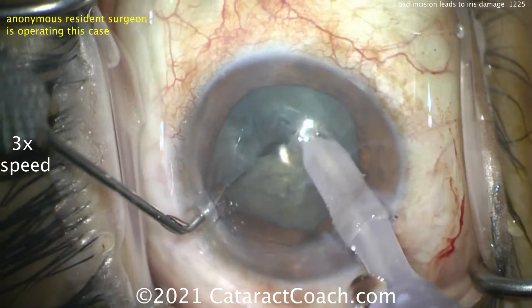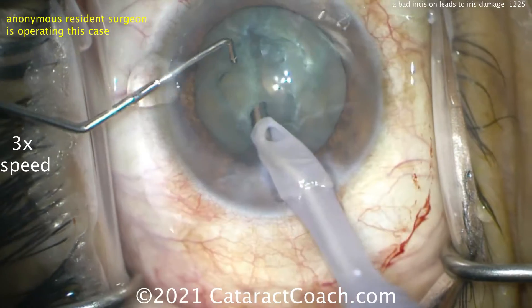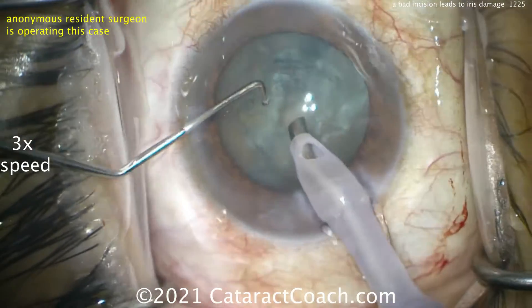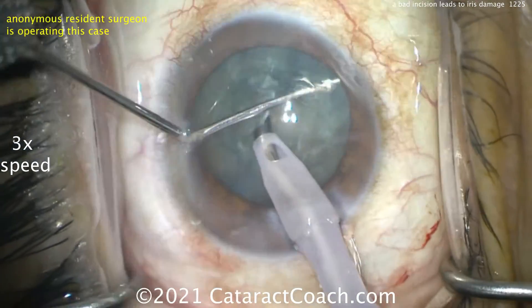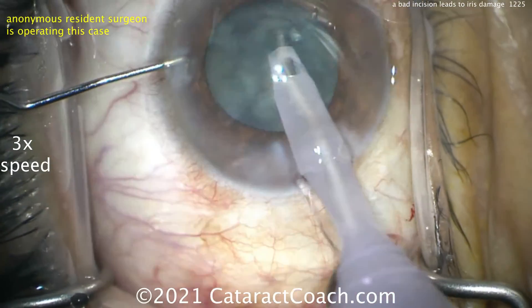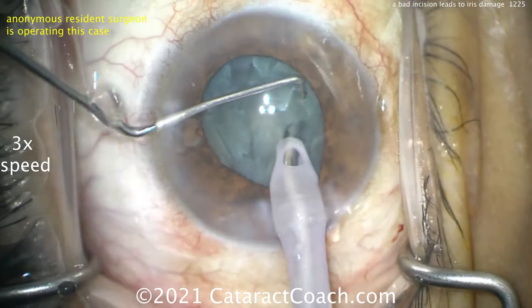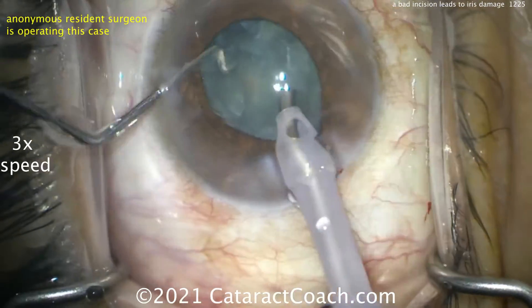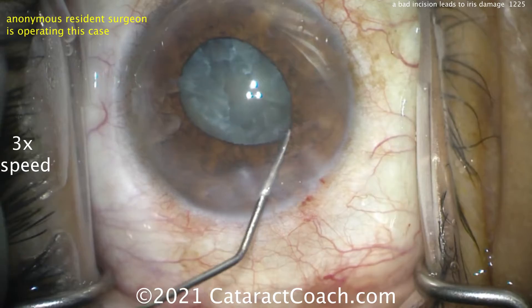This part is okay — this is making a groove, sculpting a groove in the center of the nucleus. That works okay and that nucleus can be split — that's a pretty good job. But the problem is going to be the higher flow settings when we try to bring pieces up out of the bag with a stop-and-chop technique. We're showing the video at three times speed because I want to show the whole case without it being too long.